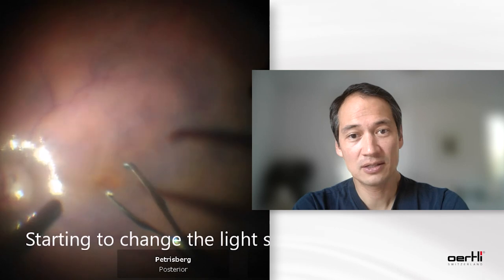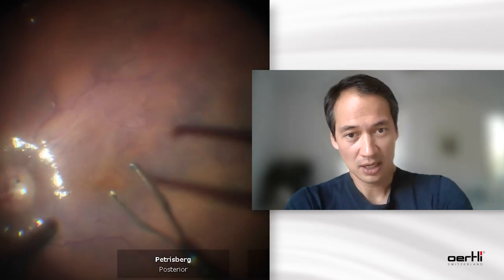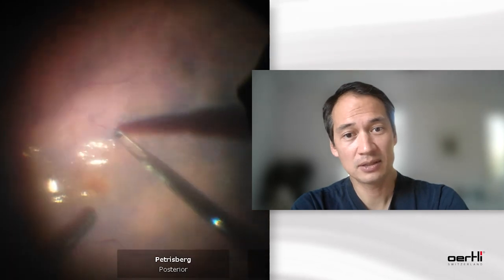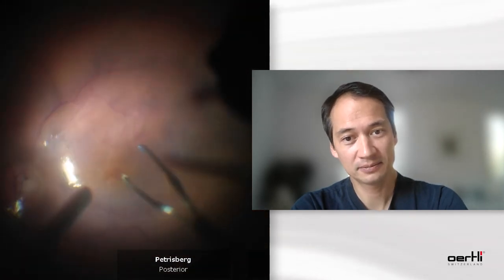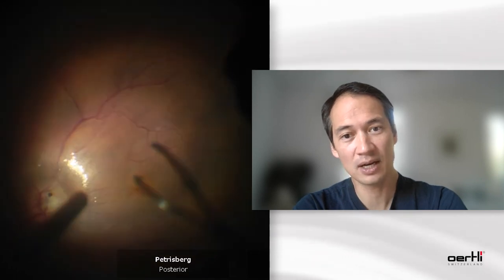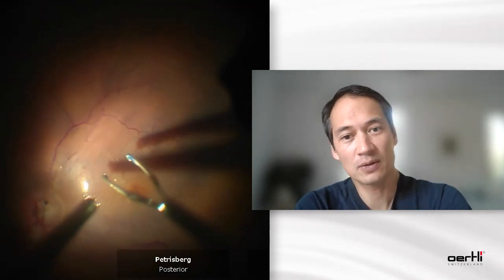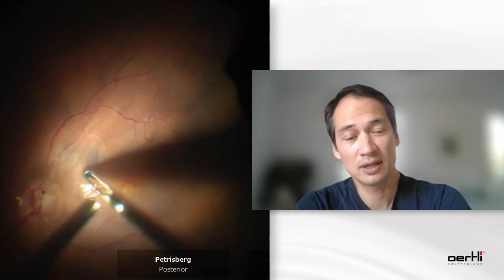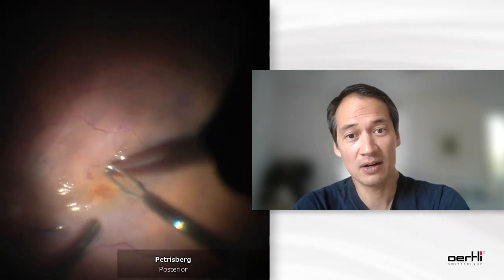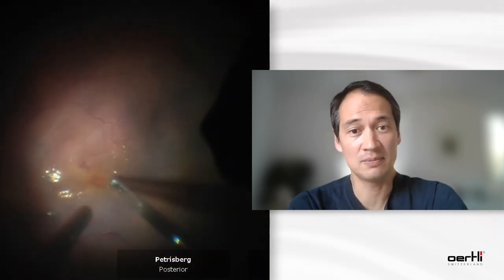And now I just start to change the light setting, and you will see that once the light setting changes, you will see the edge of the area that I've already peeled. You will see it a bit clearer for a second. Now see how the light changes and see how the edge of the peeling area gets a bit clearer. And once I catch this visualization and the part where the area ends — where I've peeled or not — this image is kind of frozen into my brain, and it's safe there.